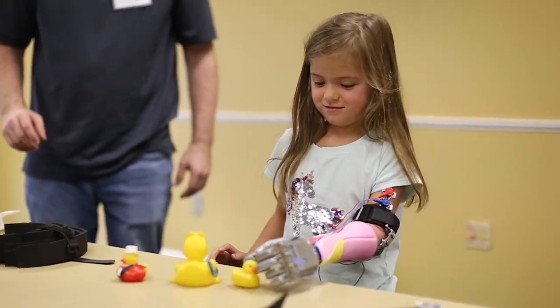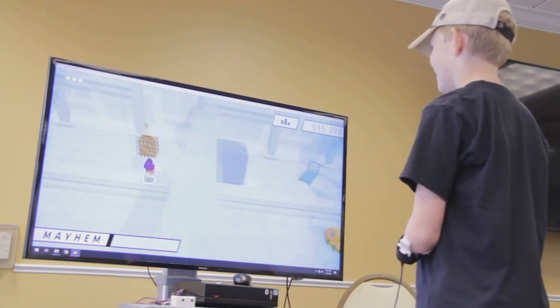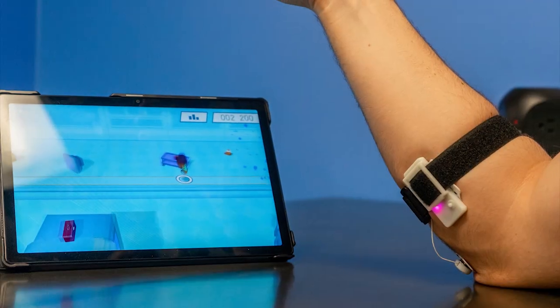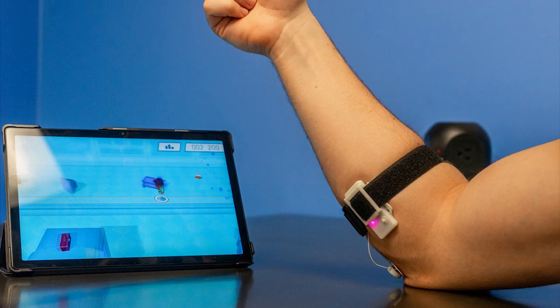We also make video games that teach the kids how to use the arms, and along the way they use a game controller that converts flexes into an analog input. The controller uses Bluetooth and attaches to any muscle.